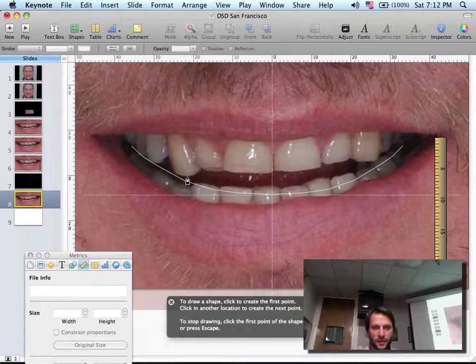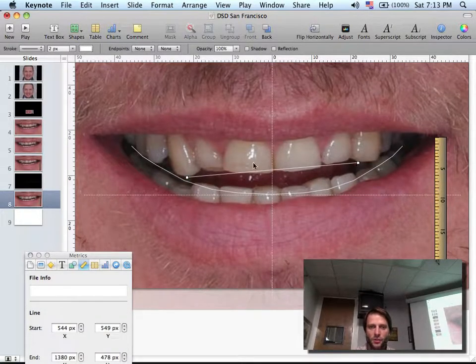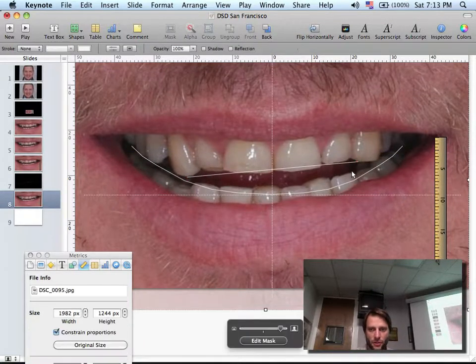tip of the cuspid to the tip of the other cuspid. Now on this cuspid you can draw, for example, this or this. It doesn't matter. You just have to remember what part of the cuspid you are so you can match it on the other. So one click over here, double click on the other, and you finish the line. If it's slightly wrong, you can click on the line, activate the dot, and move the dot to match the cuspid.